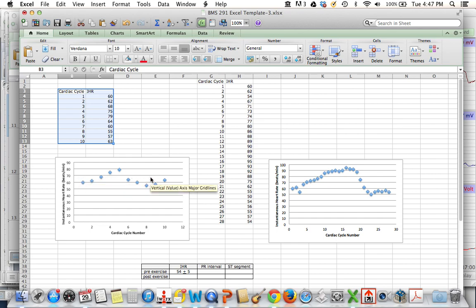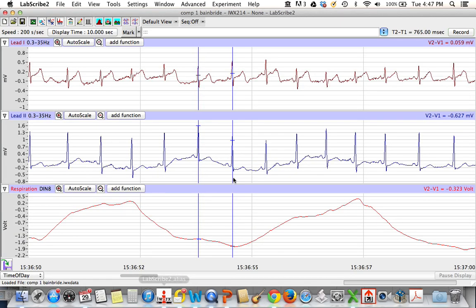What this does is that this permits us to appreciate how the changes around the average occur in response to breathing in and breathing out. And what you'll find is that it should match what you predict. It's a pretty robust type of phenomenon that we see there. So that shouldn't be a problem. So go ahead and you'll want to be able to do that.